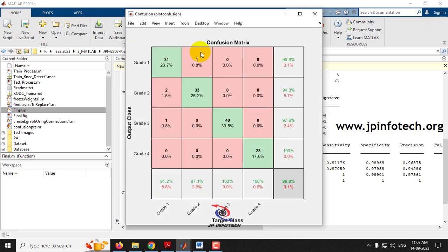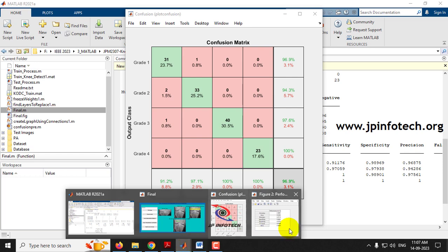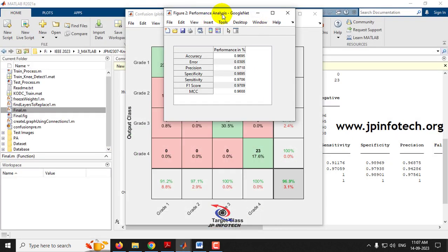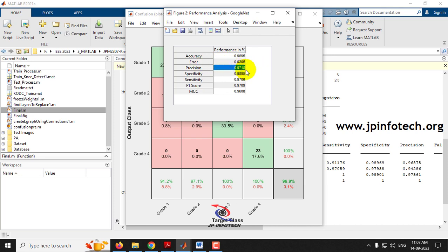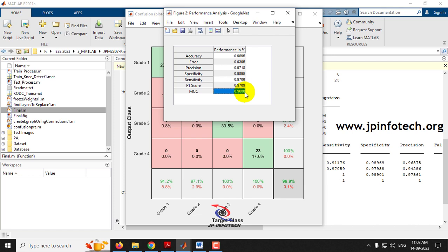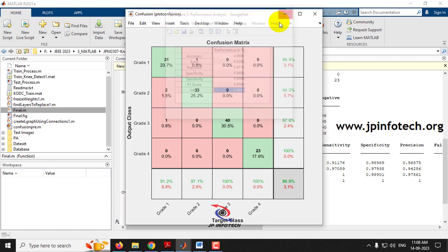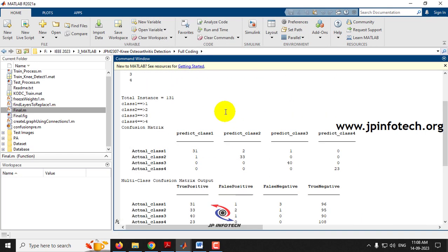First, you can see the confusion matrix, which contains the true and predicted labels for grade 1, grade 2, grade 3, and grade 4. Then comes the performance analysis of GoogleNet, which is the classification part. It shows accuracy of 96.95%, error of 0.0305, precision of 0.9718, specificity of 0.9895, sensitivity of 0.9706, F1 score of 0.9709, and MCC of 0.9608. This is the complete performance analysis including the confusion matrix.